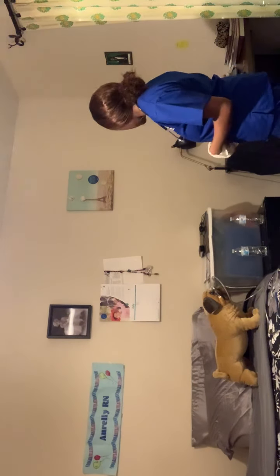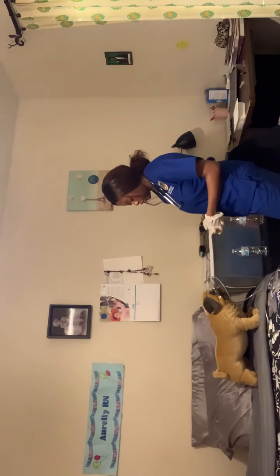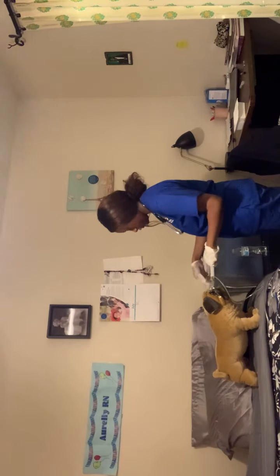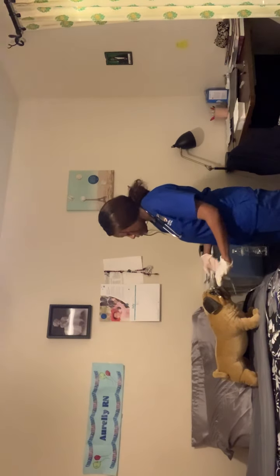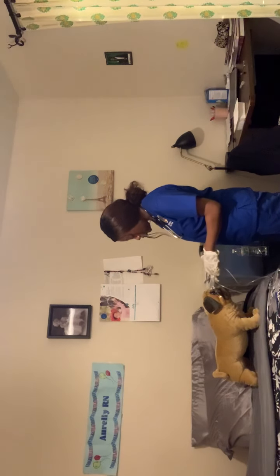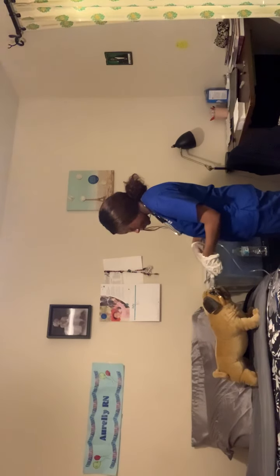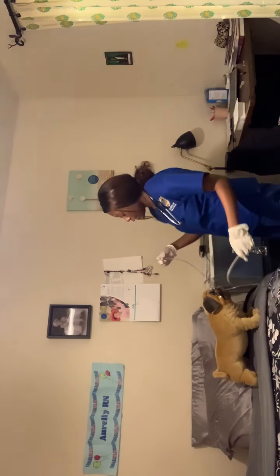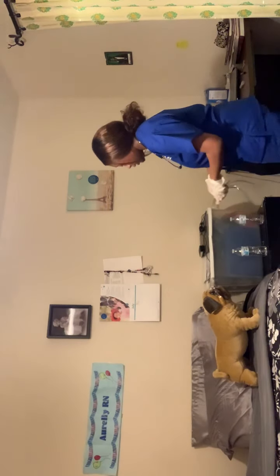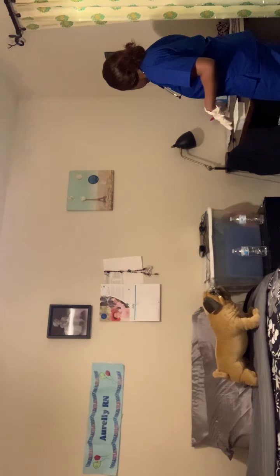And then, all right, Miss Dog, I'm now going to remove the NG tube, okay? So I would untape it from her nose, and I'll tell Miss Dog, can you please hold your breath, okay? And I'm going to remove it slowly and gently, okay? I remove it. I make sure it is still intact. Then I would discard of it in the trash.